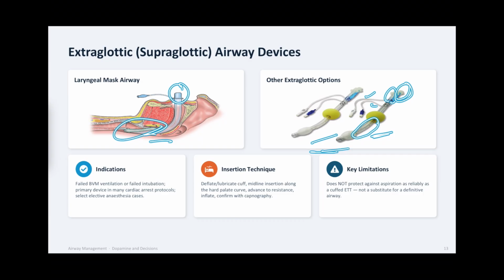Okay, if you place it in the esophagus, oxygen comes out through these fenestrations and goes inside the trachea. Whereas if you keep it inside the trachea, oxygen gets delivered through this port. That is the reason why this is called a combi tube.